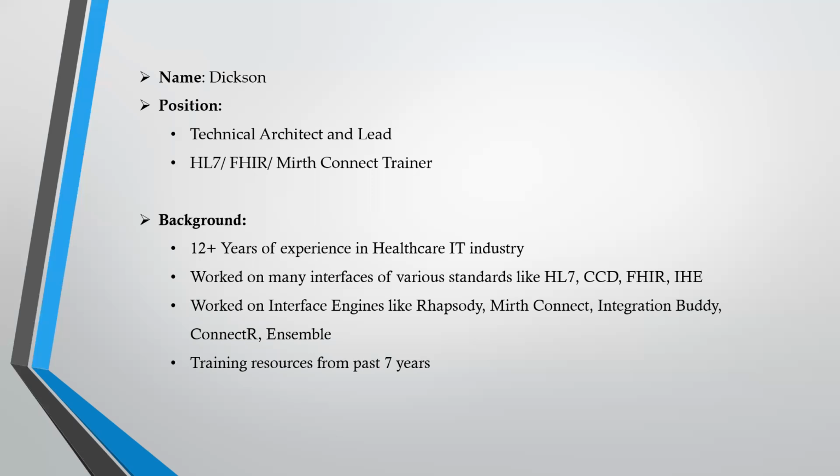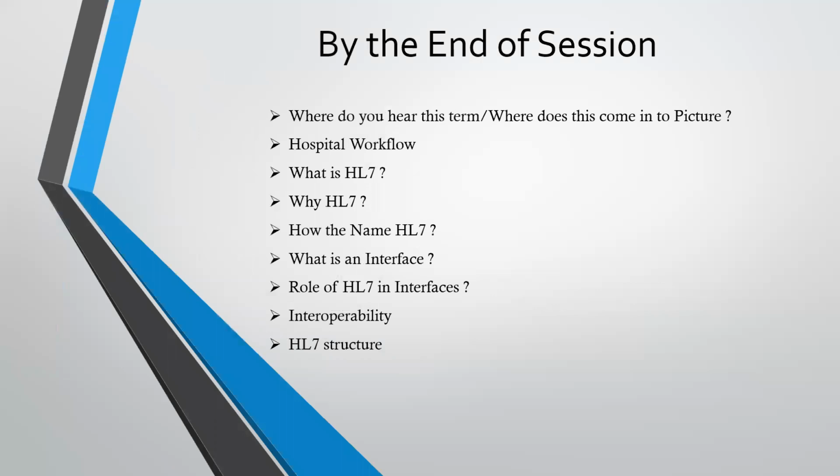What we are going to learn through this training is all about HL7. The training is designed in such a way that it will be practical and will also include a few theoretical sessions which would help us to clear our certification. But the intention is not certification completely. The whole intention is for someone to understand what HL7 is, how we use it, where we hear this term, and also to gain practical knowledge of how we use it in real-time implementations, and how we can implement an interface from scratch using HL7 as the data standard.